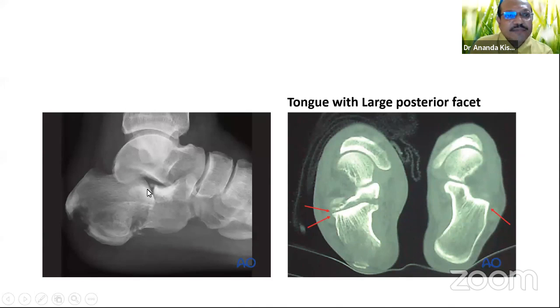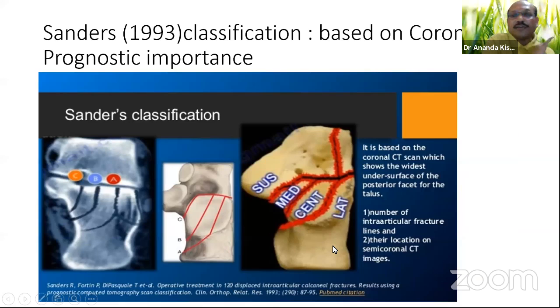See this same type, both have the double cortical contour. You can see here the double cortical contour. Even with a double cortical contour, this is still a tongue type fracture. We have to take the help of the CT. You can see here this is one component, and this component is driven inside the fracture. This is a large component, which can be easily delivered by the minimally invasive technique if preferred.